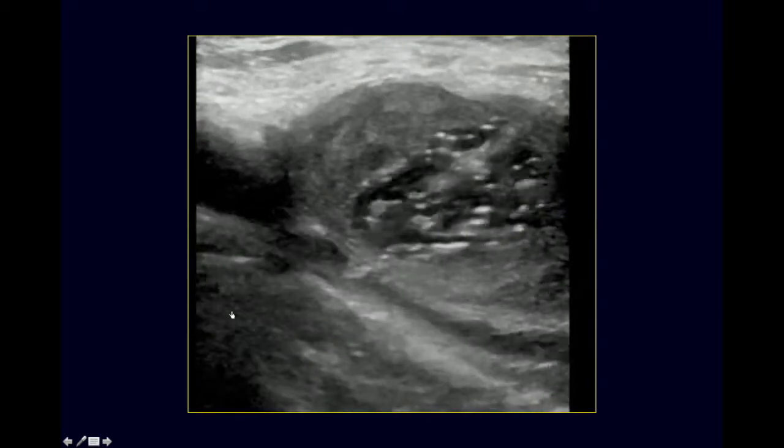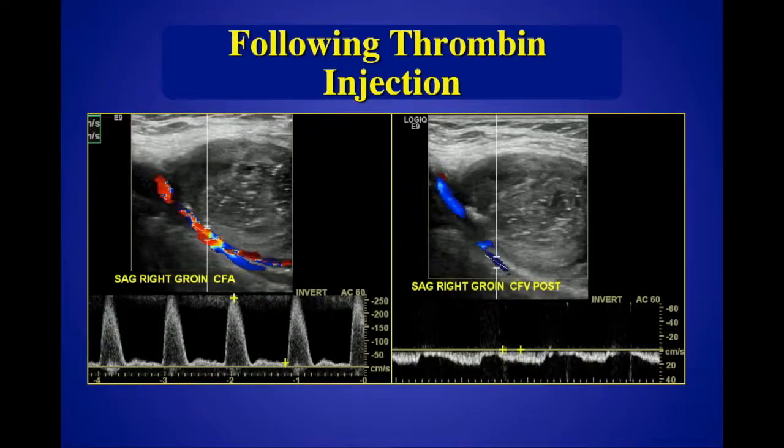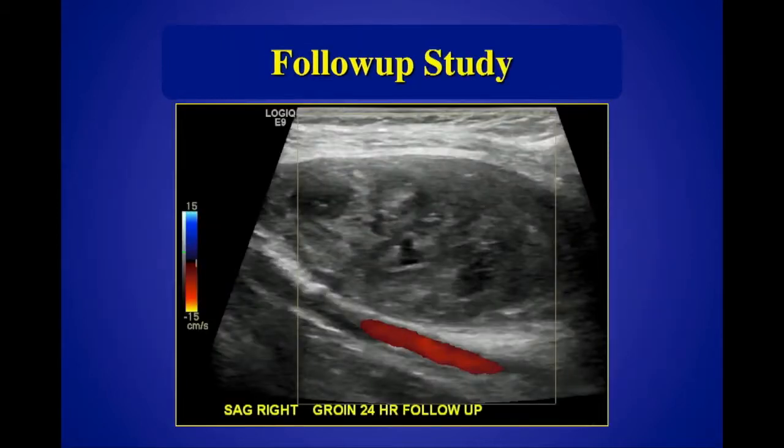Okay? The good news is that there was thrombosis of the pseudoaneurysm and there were no complications. The patient was followed for a couple of days. There were no immediate symptoms. There were good distal pulses. And when we had the patient come back, the patient was fine. So I think he got away with one, but I think that's the kind of thing they have to be careful about.